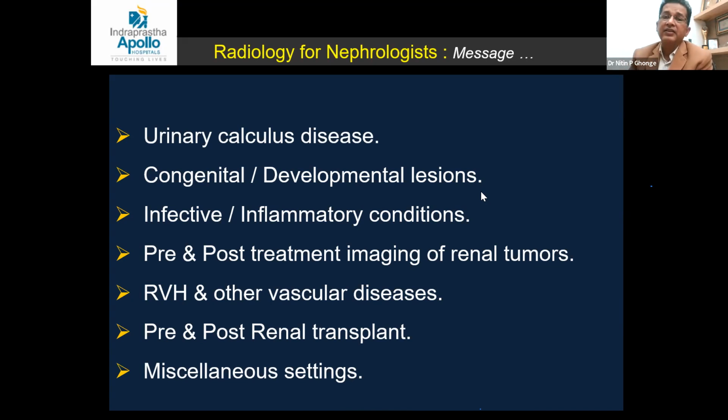And there are specific circumstances where ultrasound contrast is very useful, which everyone should understand, for focal lesions. So ultrasound contrast is also possible, but it is not done at all places, so that is the main concern. Otherwise, non-contrast MR angiography is done at most of the places.